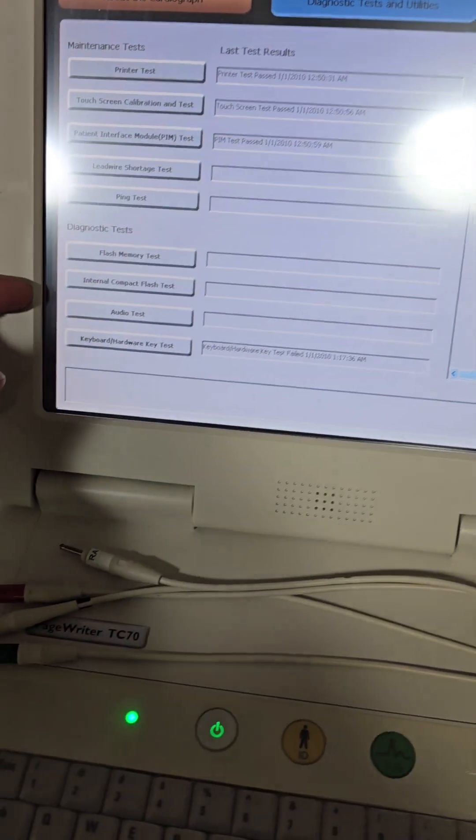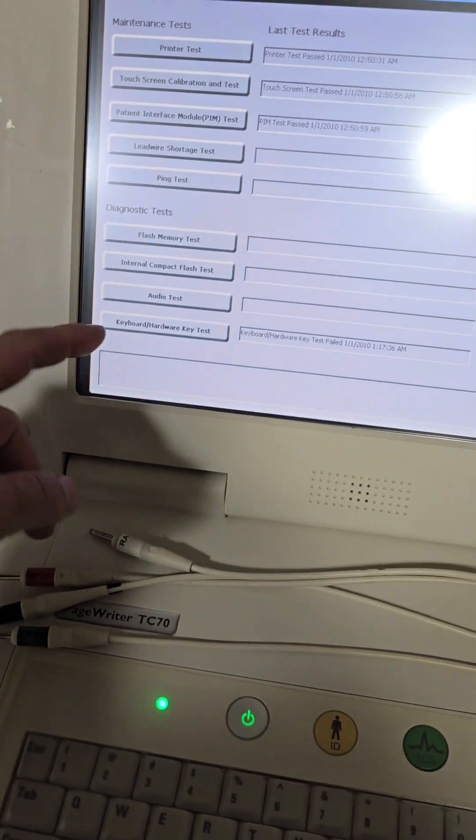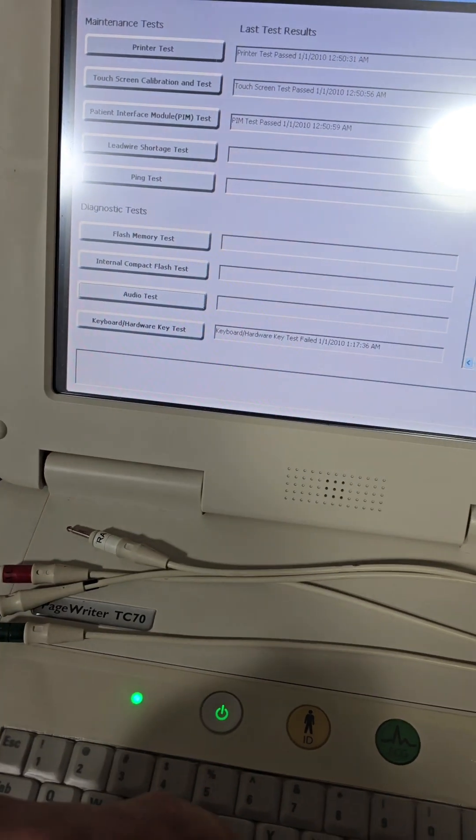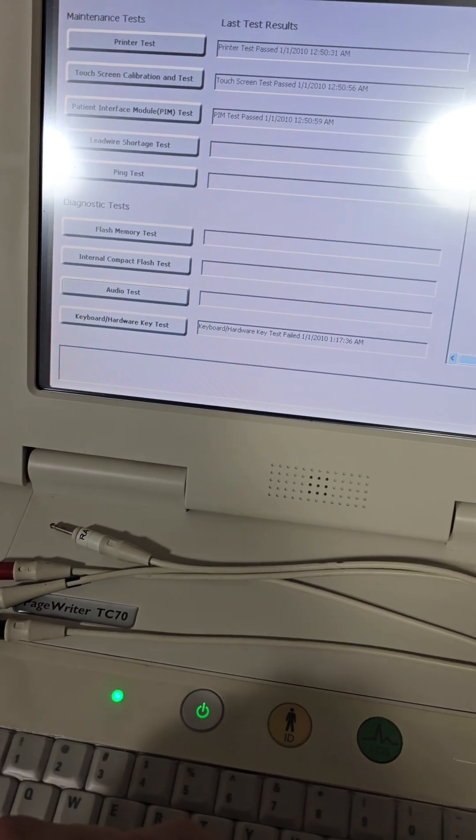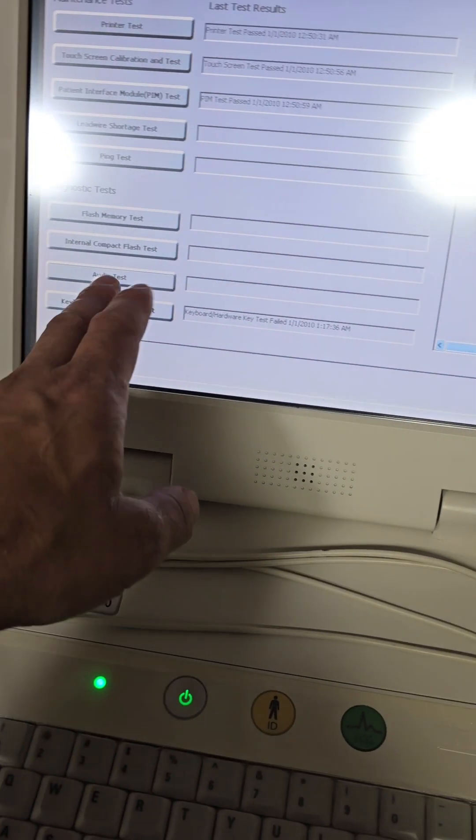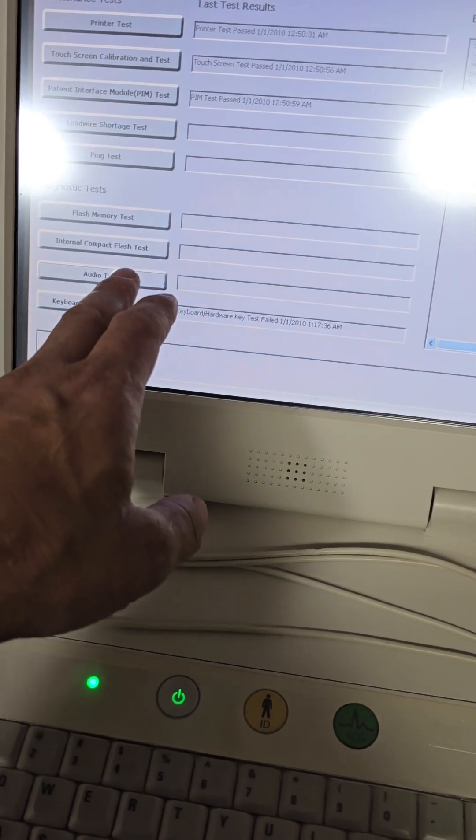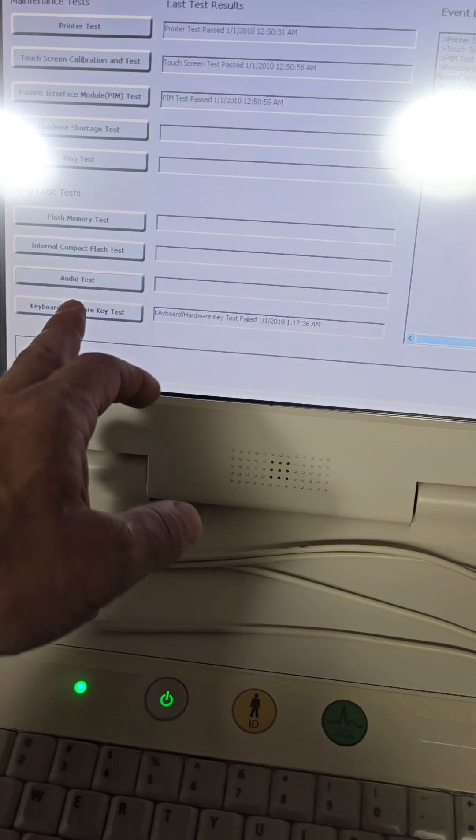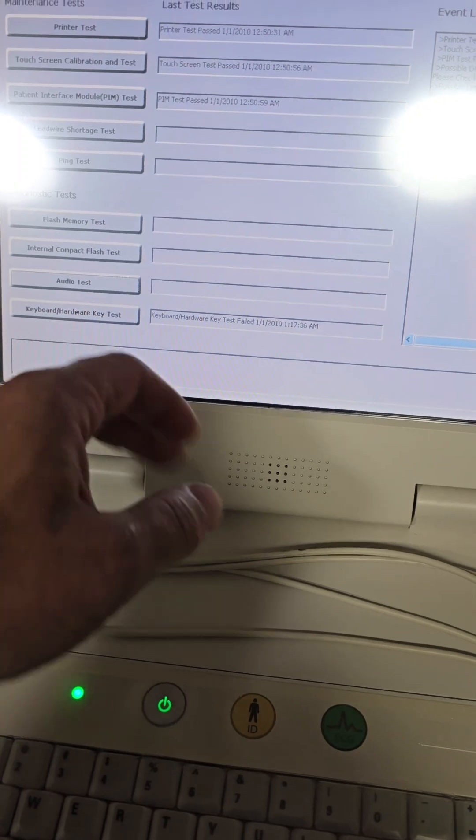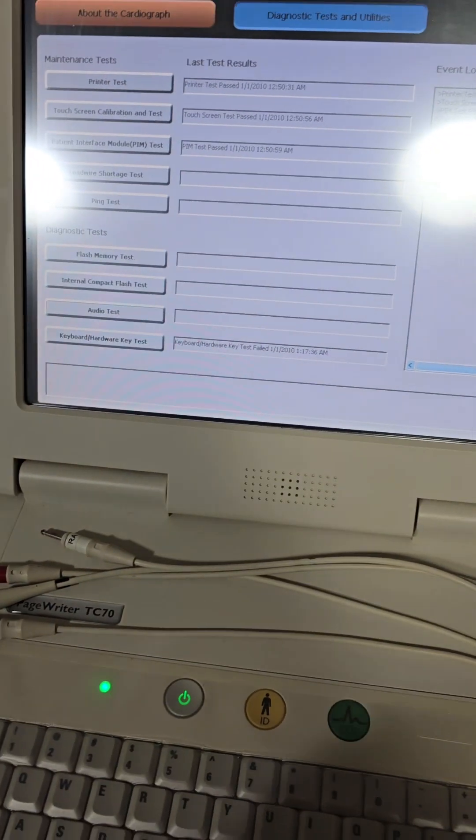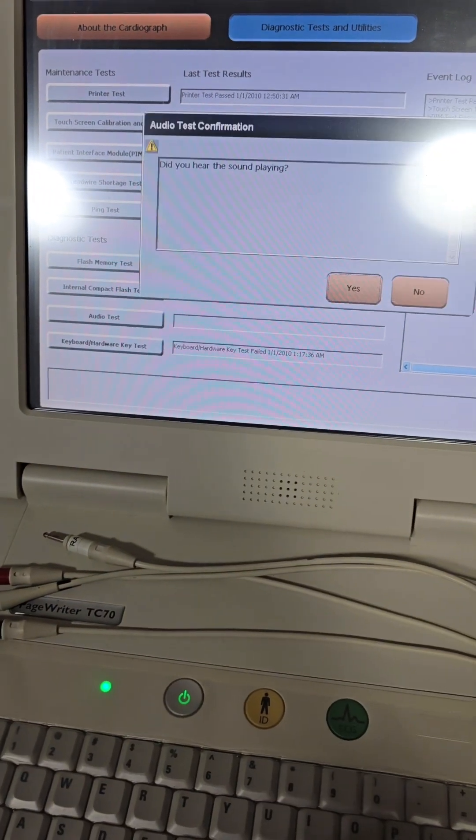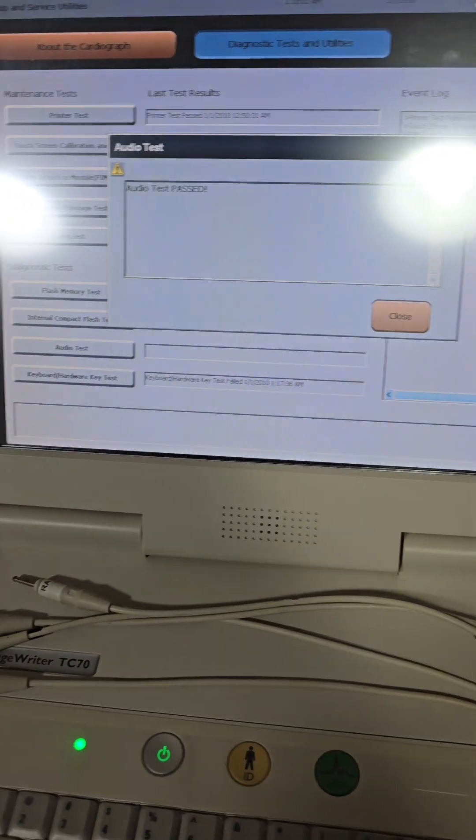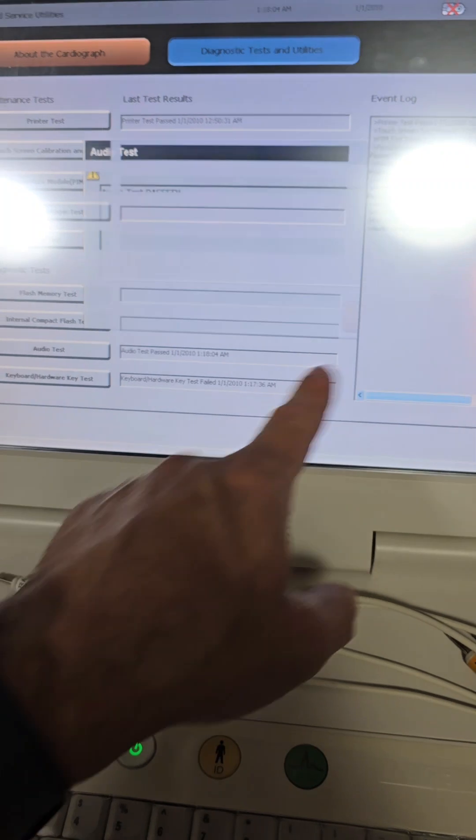Give this some memory tests. Audio is always a good thing. You hear that? We're good. I guess I press it a bunch of times. Yep. That passes.